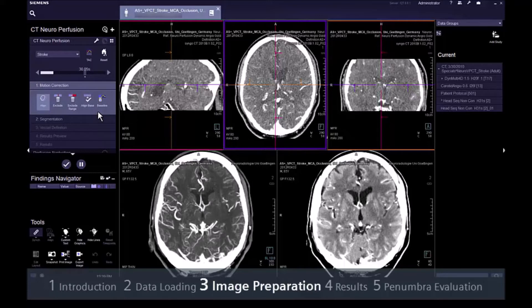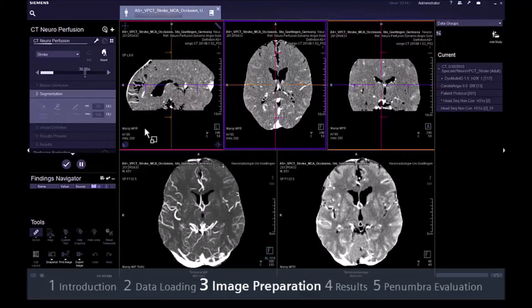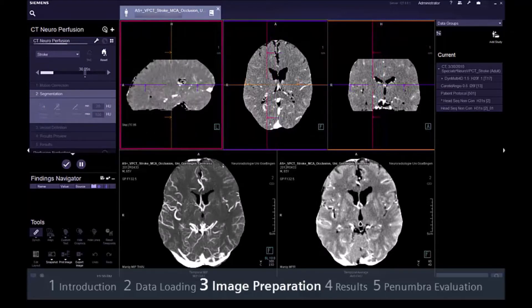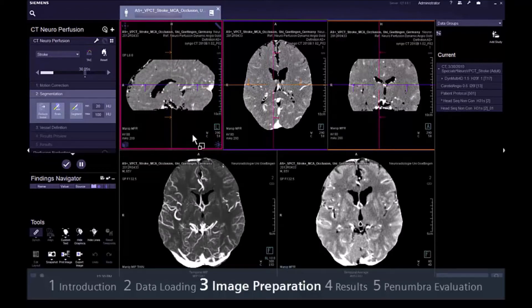After optional motion correction and deletion of critical time points, go to Step 2, Segmentation, where the 4D noise reduction can be run to reduce image noise. This is especially helpful if the data is noisy due to a protocol with low MAS. In this step, an automatic segmentation of the parenchyma is done.